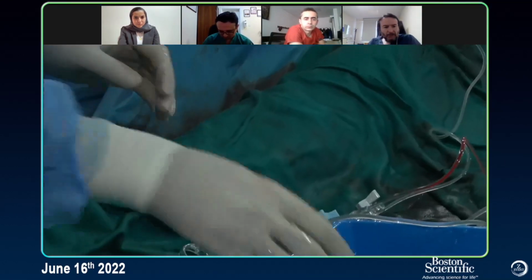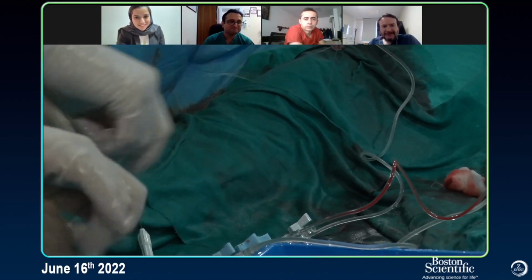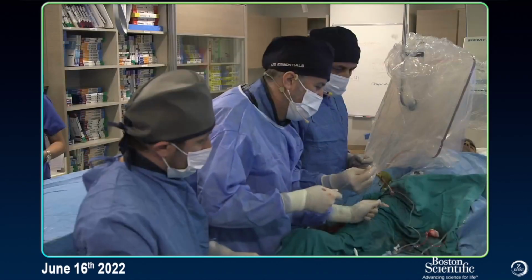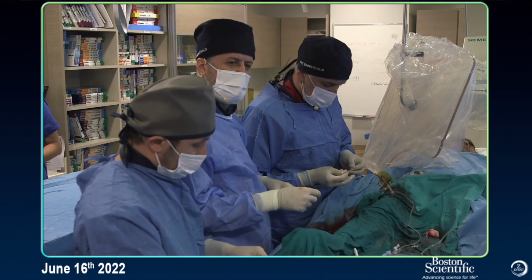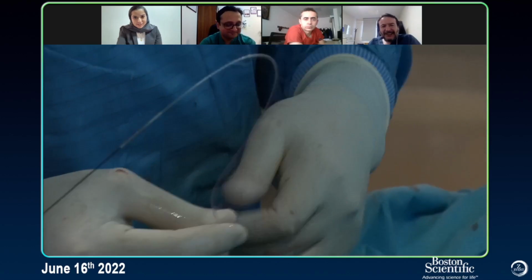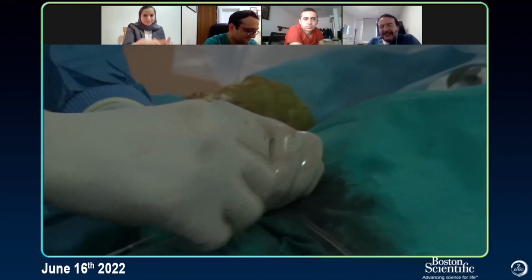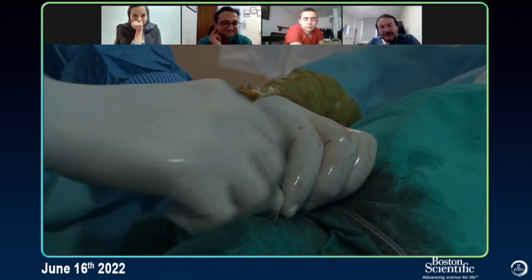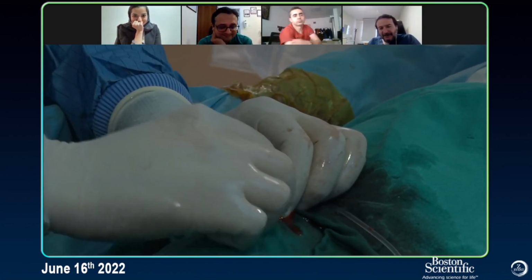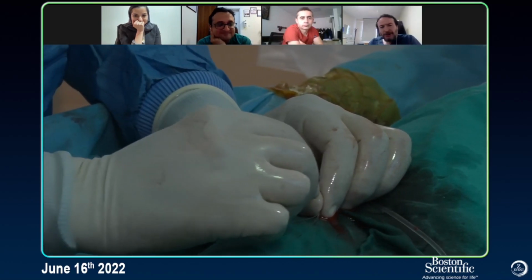Did you ask any question, Şevket? No, I couldn't follow, I'm just blabbing around. Okay, which mood are you today? Keep working, keep working. I'm in a good mood. I'm always in a good mood. When I see you working, I'm always happy. Seeing such a giant interventional cardiologist working and learning from him, it's always good. Thank you very much. Oh, come on.